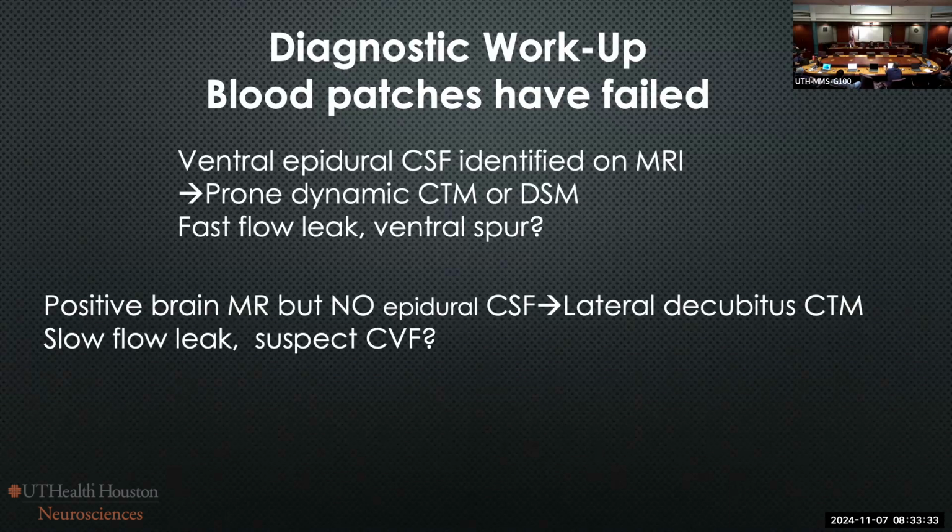You have to do the decubitus myelogram, and there's a way to do the decubitus myelogram at the same procedure time to be able to do left and right. It's not the best, but at Duke, for example, they do it at separate times. They inject on the left, and they come another day and inject on the right, especially for the fistulas. We haven't detected one here. It's very tough. I don't think our equipment is adequate.